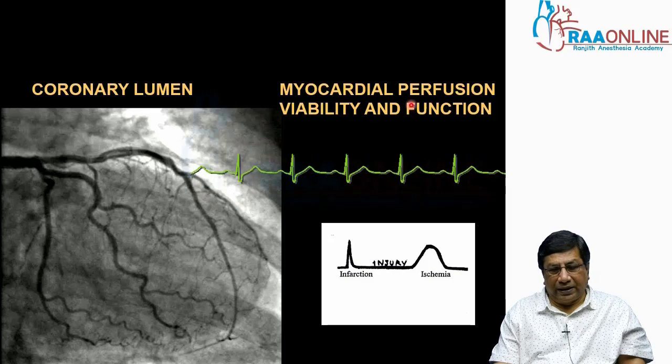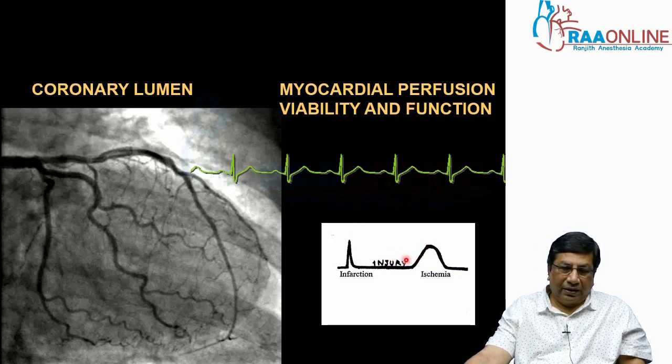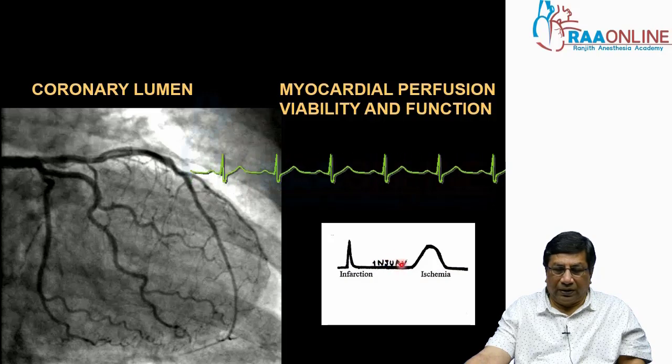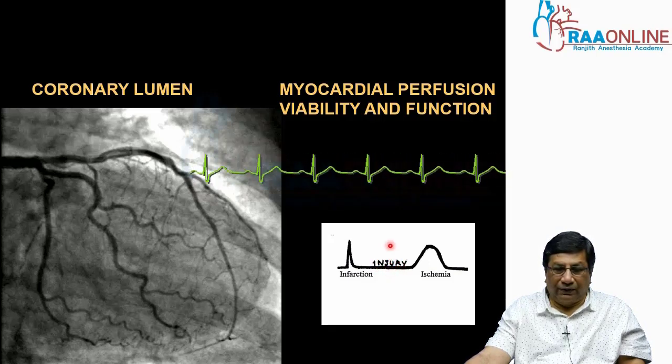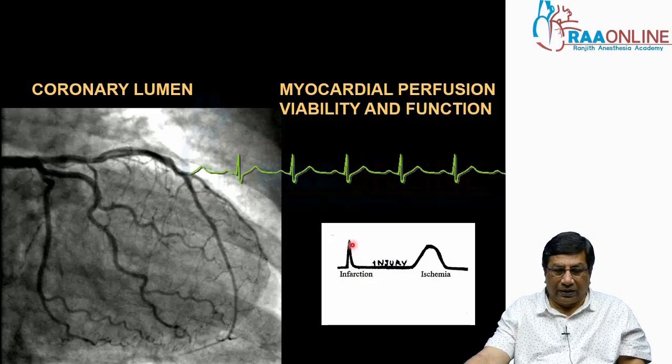So the ECG changes of coronary heart disease are divided into ischemia, injury and infarction. Ischemia affects the T wave. Injury, the most important segment of electrocardiogram is ST segment. Injury is always due to acute coronary syndrome. So acute coronary syndromes are going to be manifested in either ST segment elevation or ST segment depression. Then the infarction, a permanent necrosis of the myocardium, going to result in pathological Q wave and the loss of R wave.